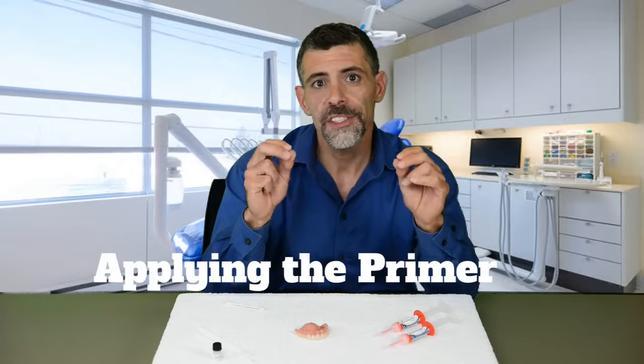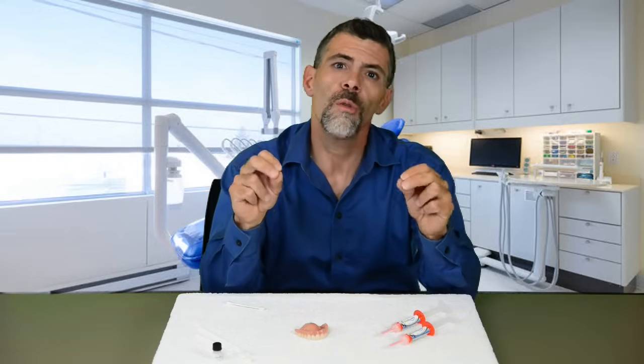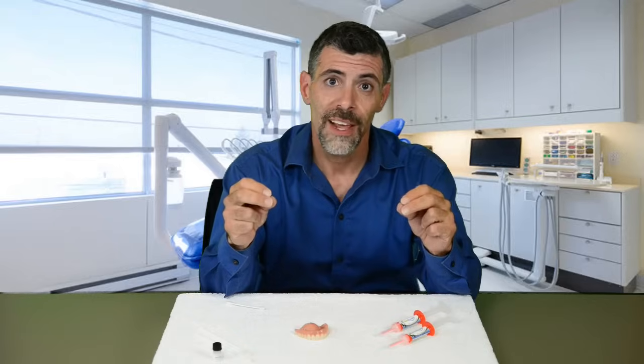Make sure your denture is completely dry before applying the primer. The primer has an organic tacky substance in it that makes the silicone stick to your denture. It is only necessary to prime on top of your hard acrylic denture or over a soft reline from your dentist.